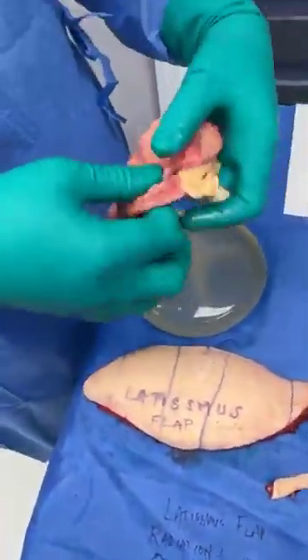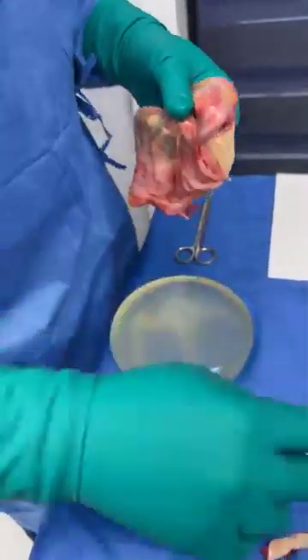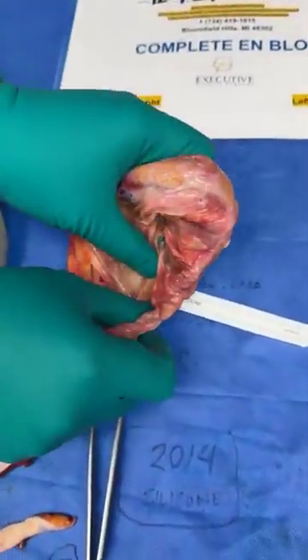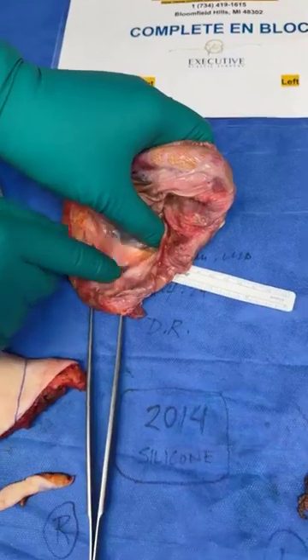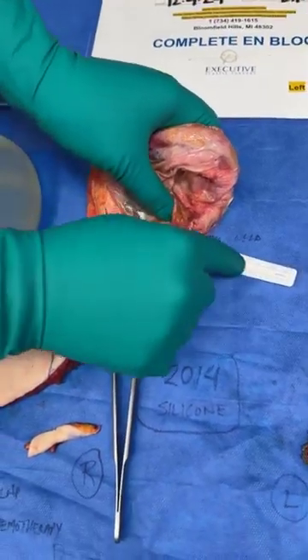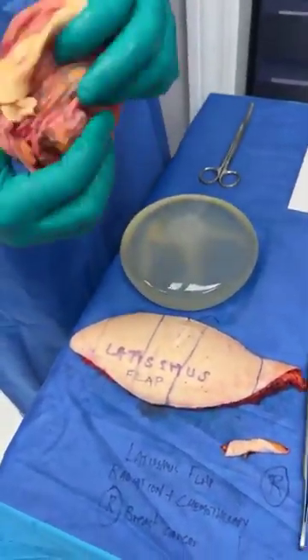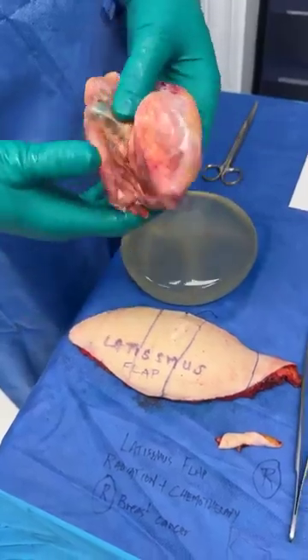And I'm very happy and content with how the whole dissection has gone. Look, if I put the ruler here, how thin this capsule is. No matter how thin, this surgery can be done safely, definitively. I've heard some surgeons say, look at the mark that I put here. Obviously this transferred over.